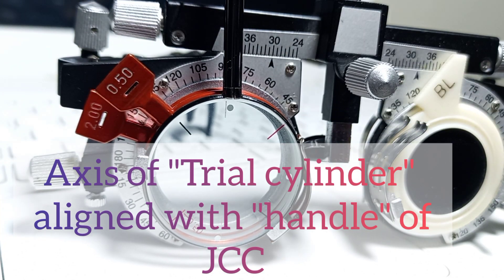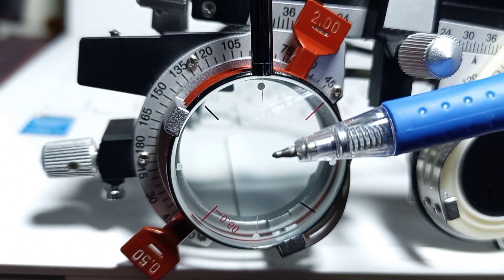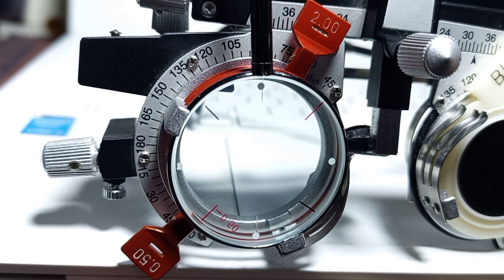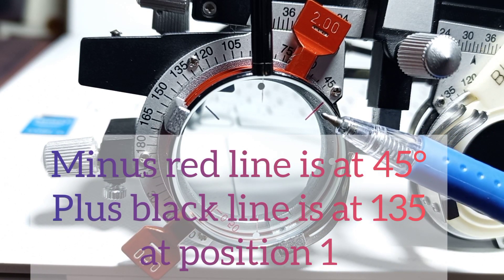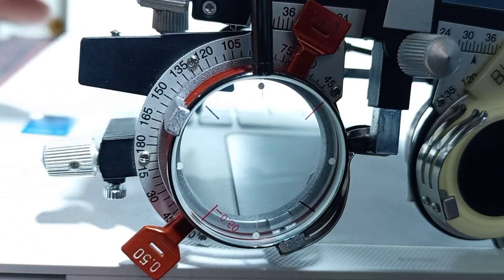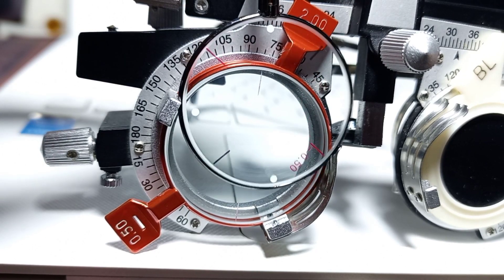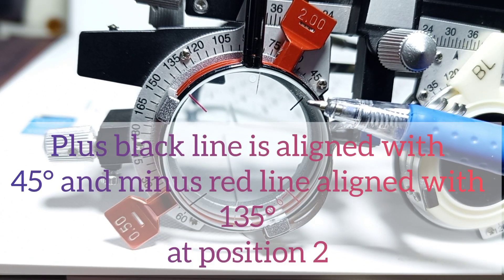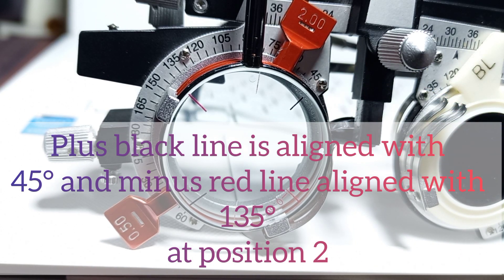Now the handle of the Jackson Cross Cylinder is aligned with the axis of the trial cylinder. When the handle and the axis are at the same place, you can see the red line of the minus cylinder is aligned with 45 degrees at position number one. Now if I flip the Jackson Cross Cylinder's handle at the same axis, you can see the plus line is aligned with 45 degrees — this is position number two.